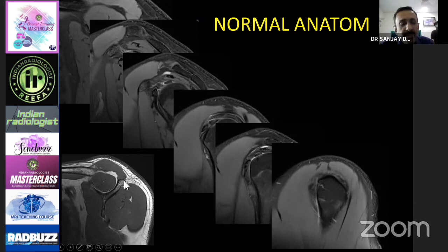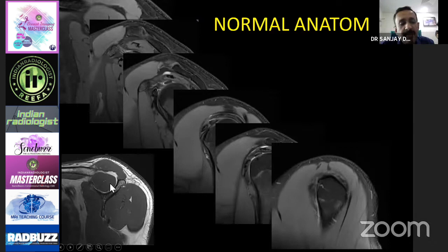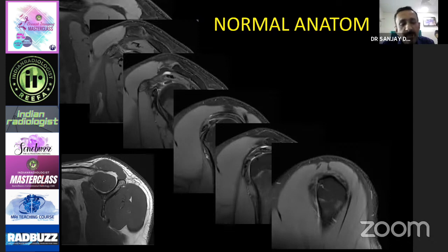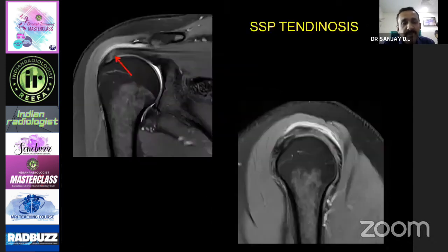The sagittal T1-weighted sequence shows a normal muscle belly appearance. When you start seeing bright fat within the muscle belly, that is called fatty replacement. This is further graded as grade 1, 2, 3, and 4, as we will see later.